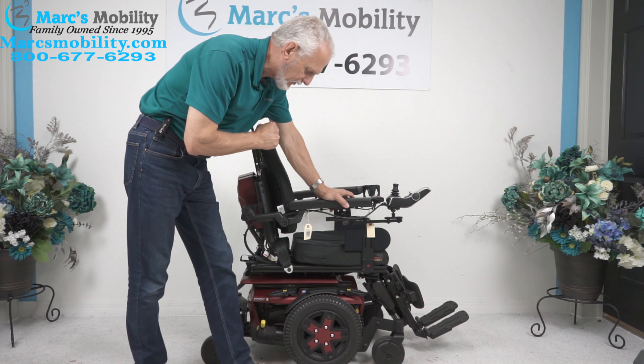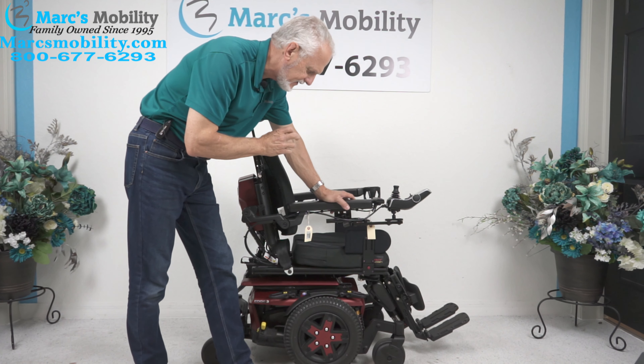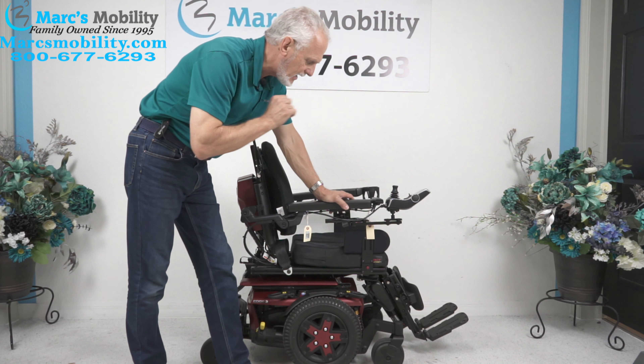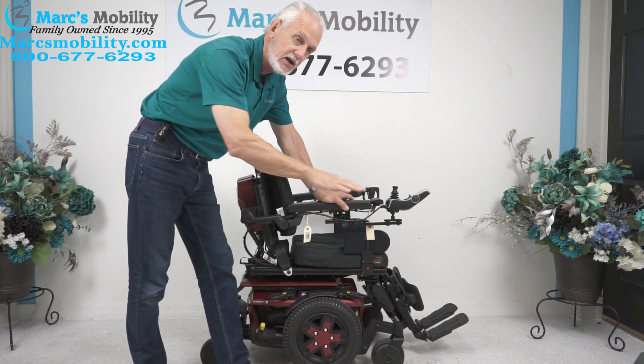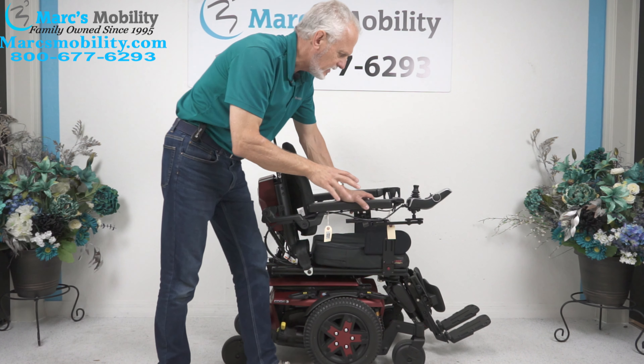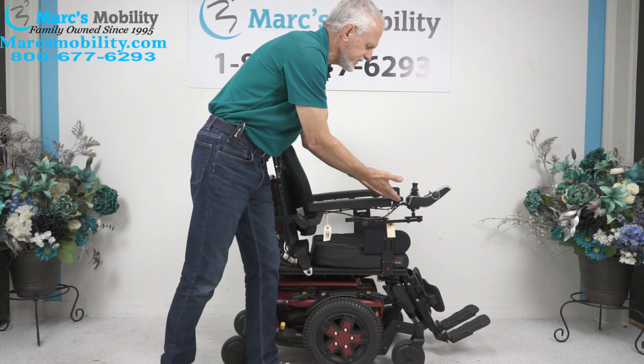We have here a Quantum Edge 3 power chair. This power chair is the latest in technology from Pride Mobility. This power chair has one mile. It has electric tilt, electric recline, and electric legs. All the functions for the seating system can be worked through the joystick or through the switch box.